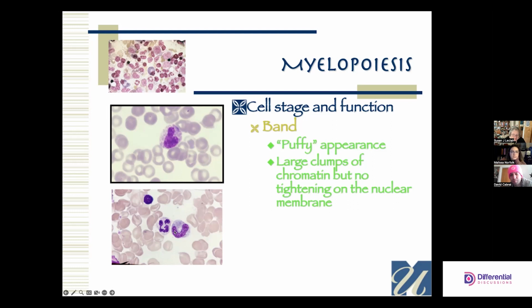And this one probably easier. There are two big aggregates of heterochromatin here and here, maybe a third one there, but the rest of them are kind of scattered. That's not a fully matured poly. This, on the other hand, look how dense it is. I don't care about the segment or the twists, I suppose, although it could be a balloon after somebody's made it into a dog. At a fairground, I was barely able to twist. So what do I know?